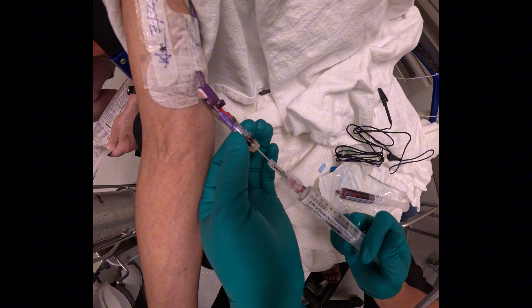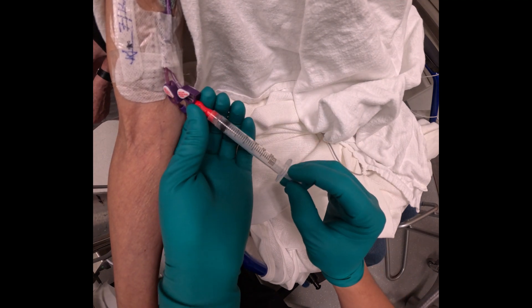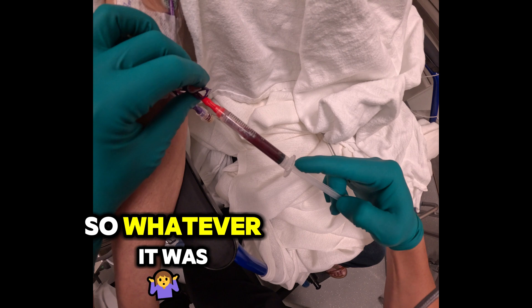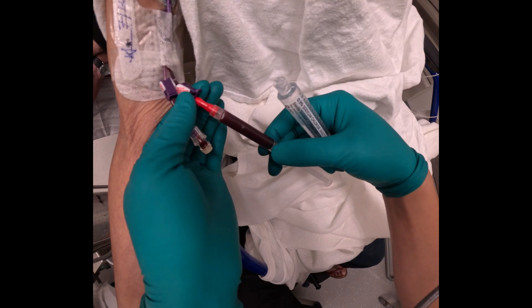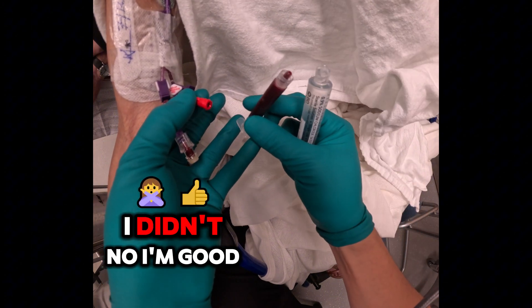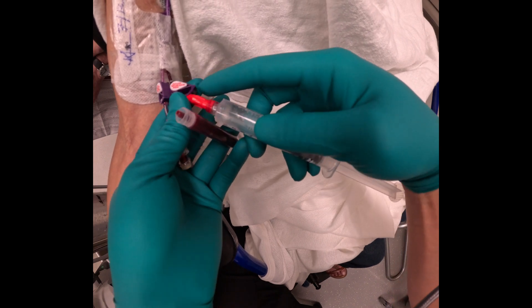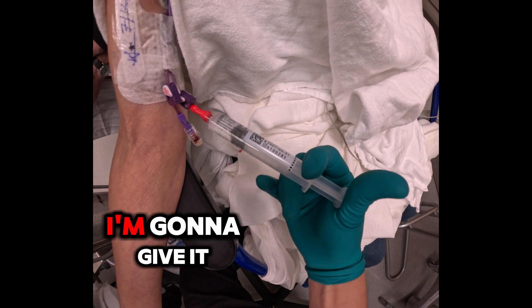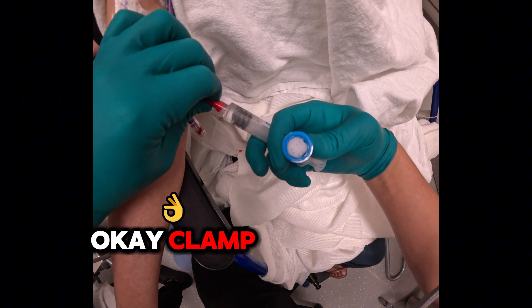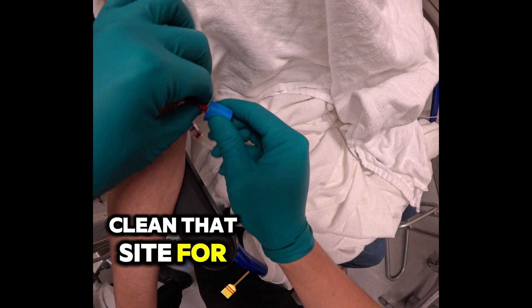Flush your line. We are going to waste what's left over. Pull that out, flush that line. There we go. Now I'm going to give it another clean because I don't like to see blood on my hub. Clamp. Clean that site — a full 15 seconds.